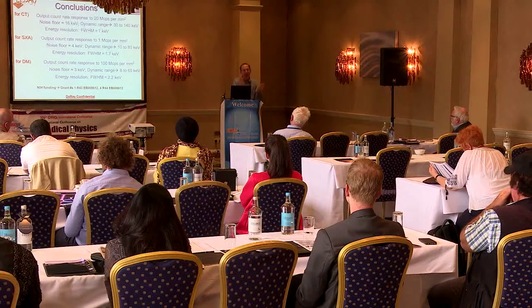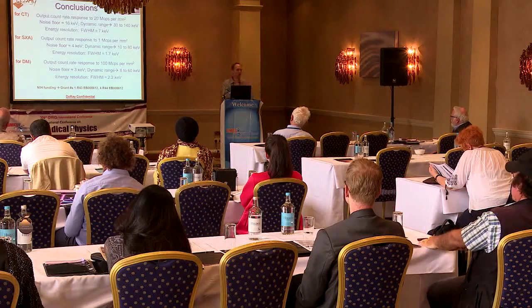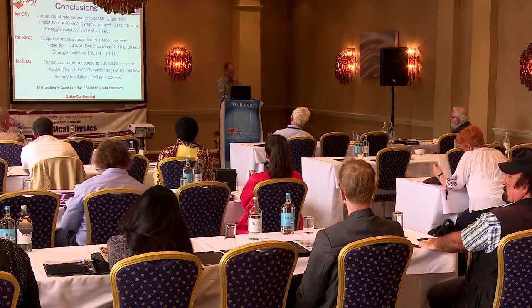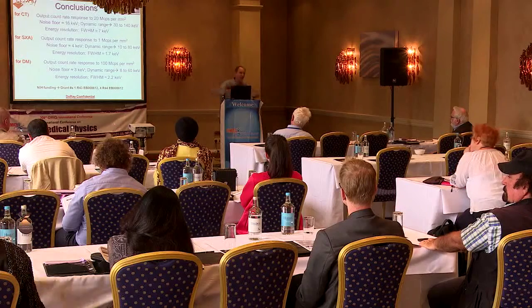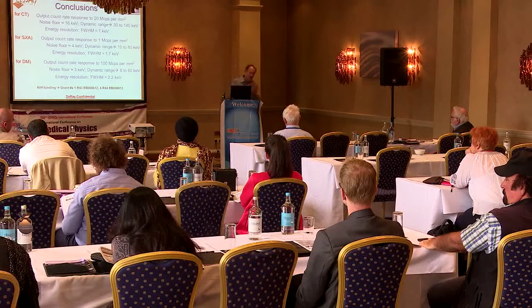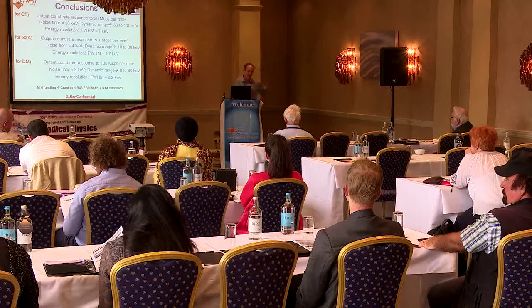If we optimally weight each one of the 4 images with an optimal energy weighting factor and then add them together, it will bring out the contrast of a particular object, and it will reduce that quantum noise because we've added the images together. But you do pay a small penalty, because anytime you add together or subtract 2 statistically independent data sets, there's a small noise penalty that is paid there.